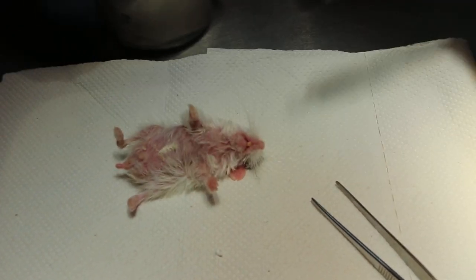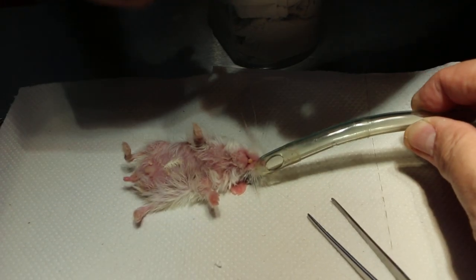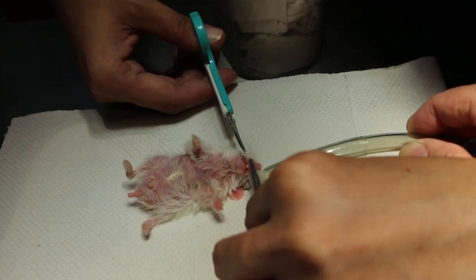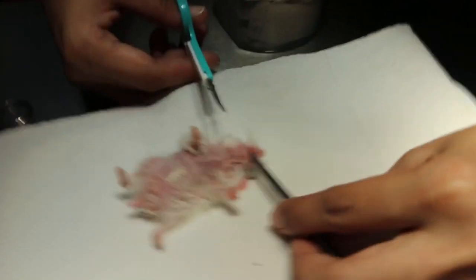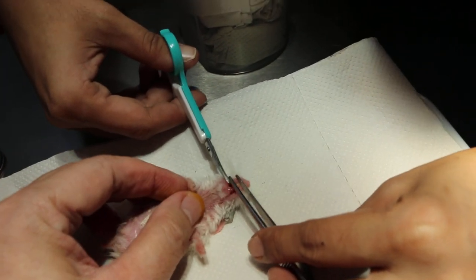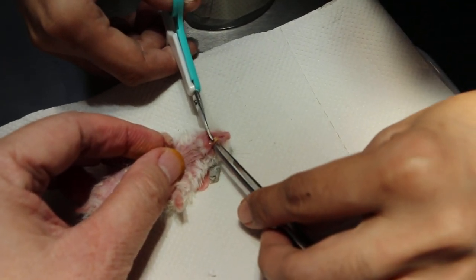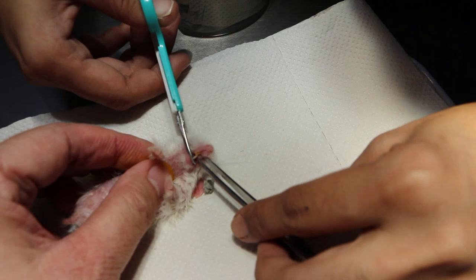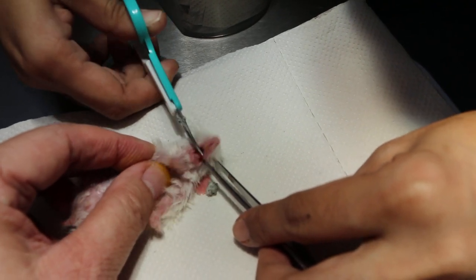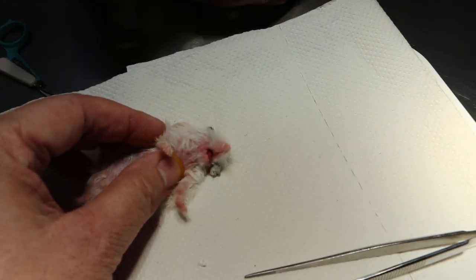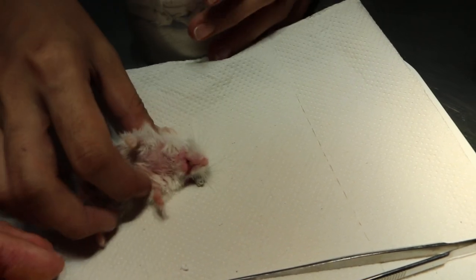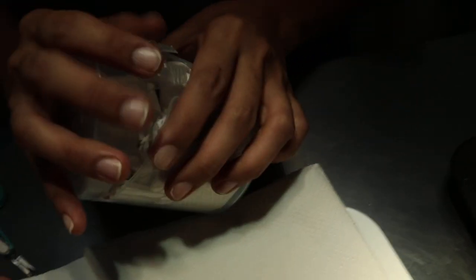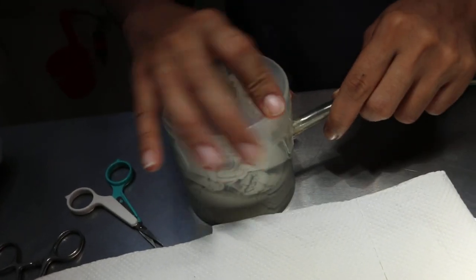Let's just sniff a bit here. Open the mouth. Yeah, not too long. Yeah, this one fractured. Cut until zero. Okay, then he will be able to eat already now. I'll put it back in first for gassing. Put back in now. A bit of gas. So one thing done now. It was the lower teeth was one fractured.